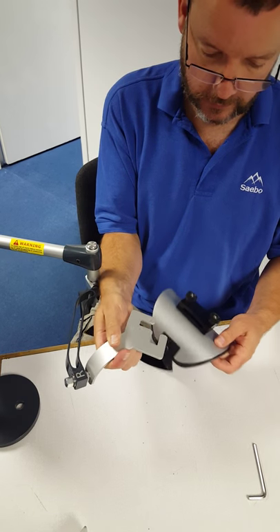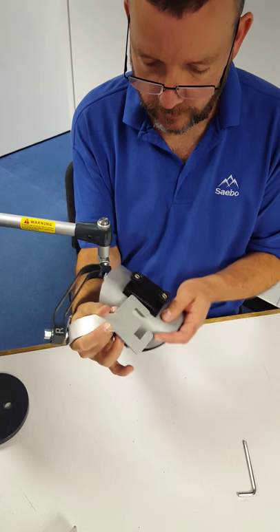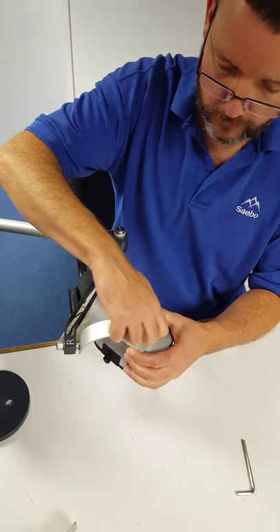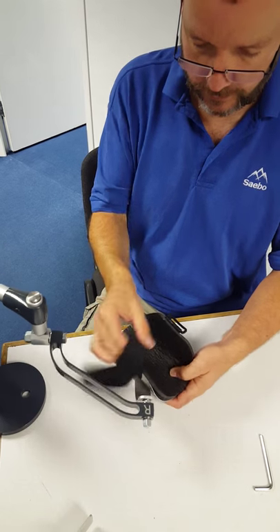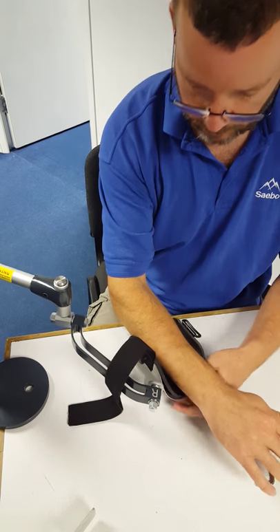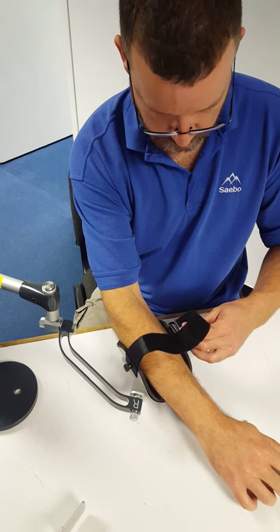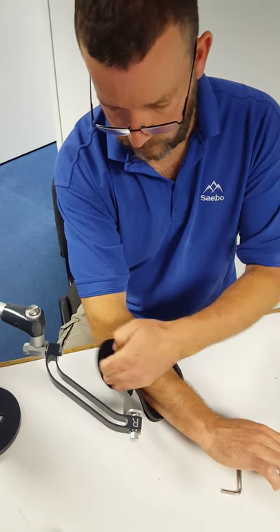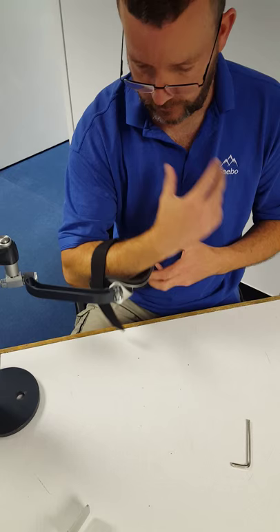There's the attachment site for the strap — slots in, tightens up. You then spin it around. You've then got your system where your arm comes in, strap comes over through the buckle, and now you've got the ability to pronate and supinate.